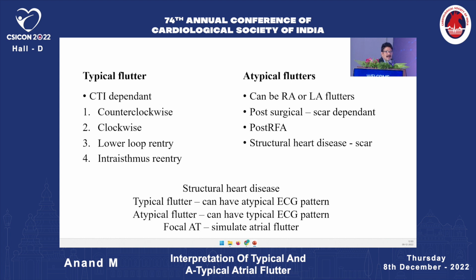So in patients with structural heart disease, typical flutter can have an atypical ECG pattern, and atypical flutters can have a typical ECG pattern, and focal AT can simulate atrial flutter. This will come in the following slides. So based on ECG, we cannot make a clear differentiation between typical or atypical flutter in patients with structural heart disease.